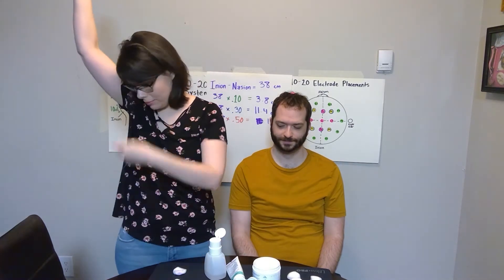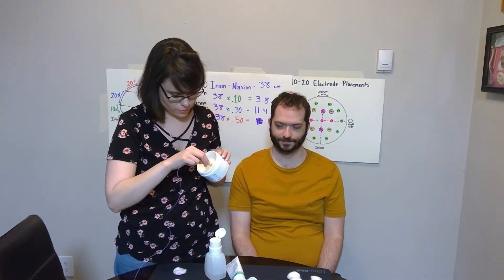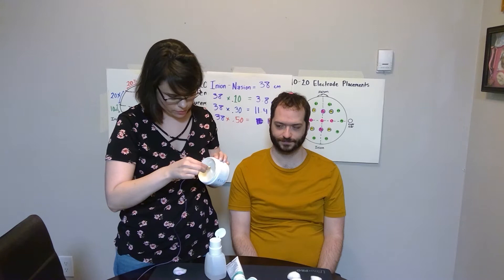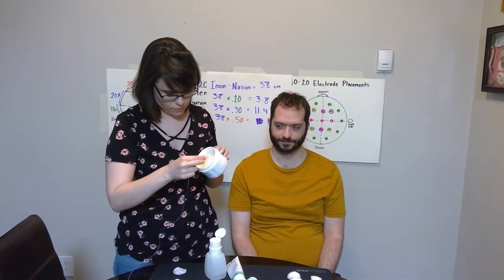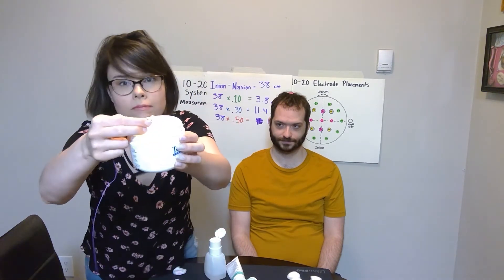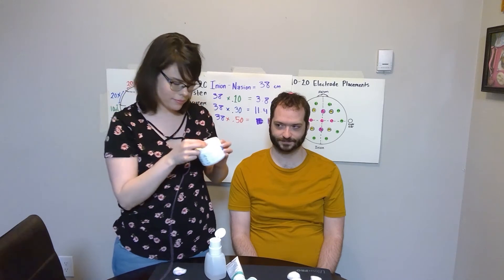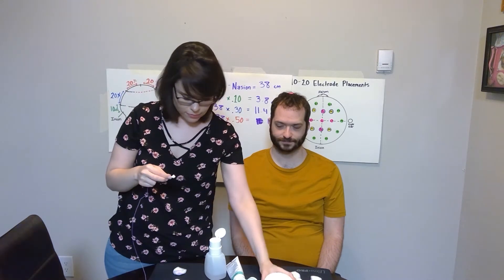We're going to scoop out some of the 1020 paste using the head of the electrode, kind of like an ice cream scoop. We're going to want the size of the scoop to be about the size of a pea — not too big, not too little.